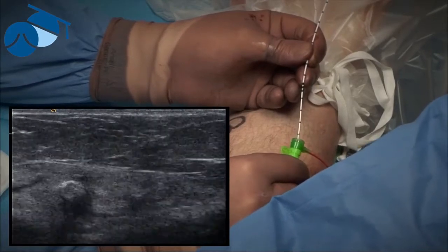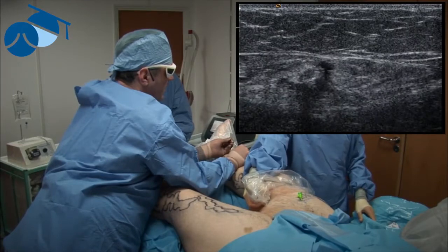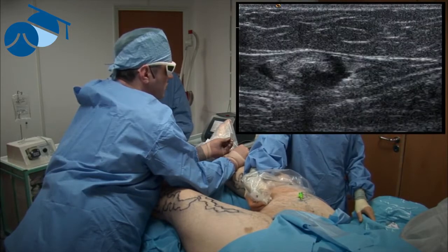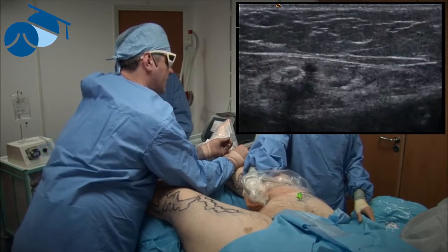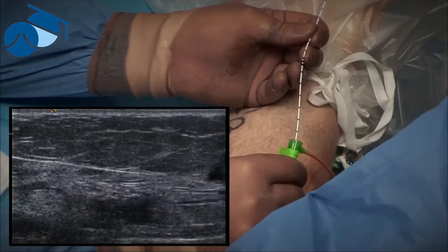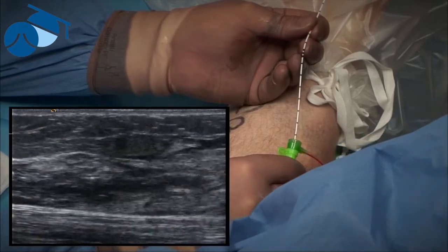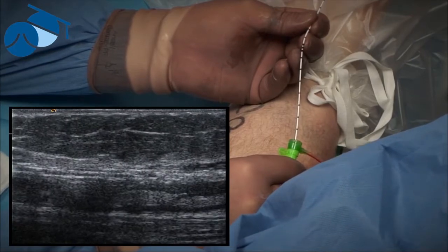If there had been inadequate energy transfer, you still can quite often see at this stage the situation, you wouldn't have got a thrombus at the moment, so usually at this stage what you see is the vein still squishy. So if you haven't put enough energy in, so your LEED's been down in the 30s or 20s, which some systems have suggested, at this point it'll still be squishy. It may look good at 1 week because you'll have thrombus within it, but you can rest assured that at a year a lot of them would be reopened using those sorts of low energies.